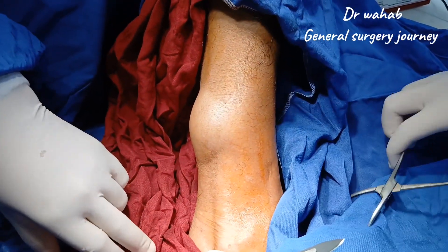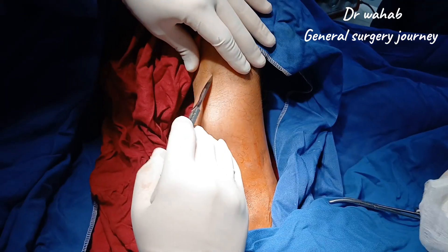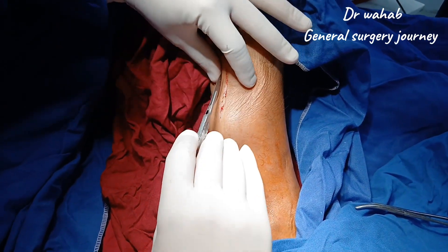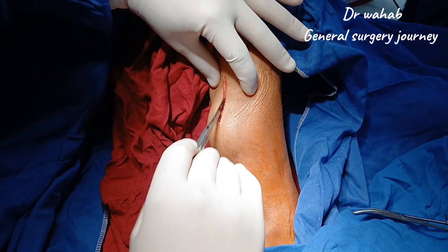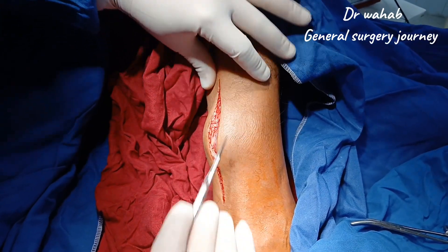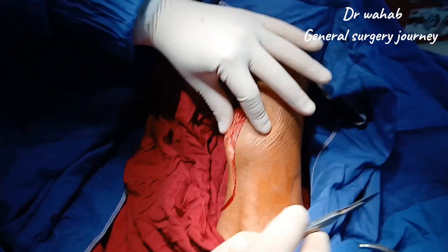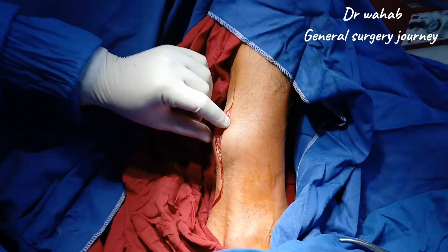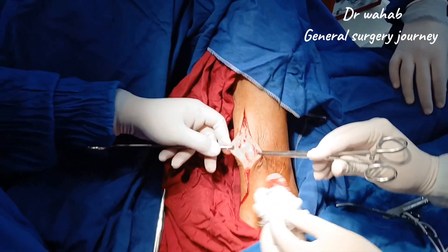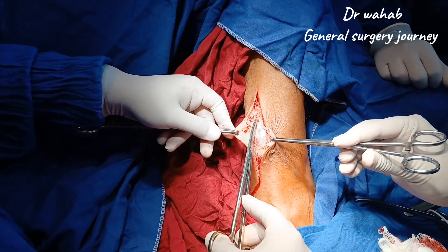After proper painting and draping of the limb, we begin with the linear skin incision made directly over the most prominent area of the swelling. The incision is carried down carefully through the skin and subcutaneous tissue, maintaining good control of small bleeders using monopolar cautery. The aim is to achieve adequate exposure while preserving the surrounding healthy tissues.